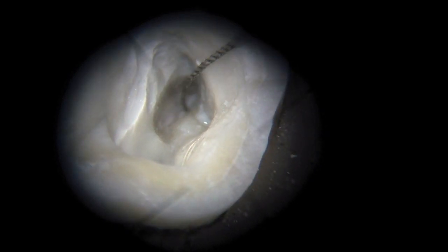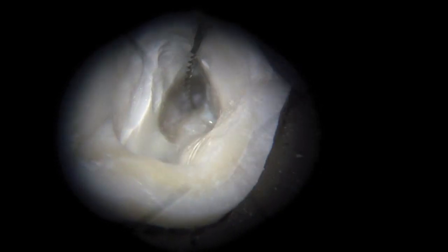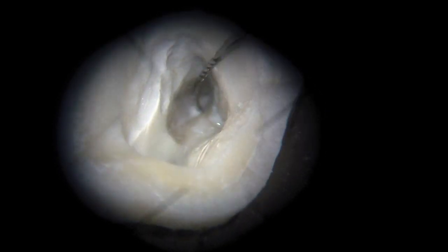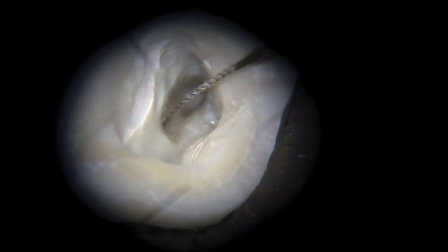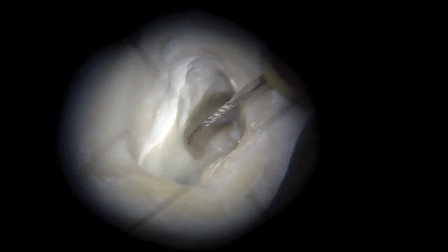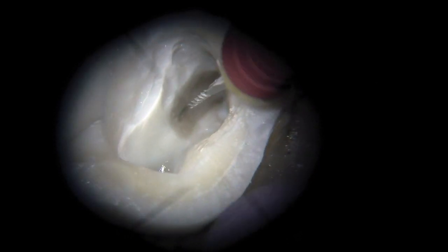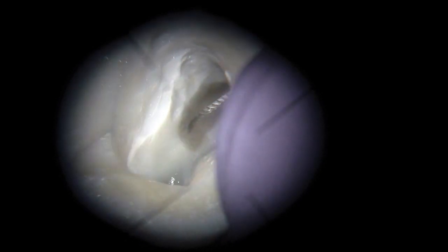What I'm trying to show here is that MB1 goes right around the corner — the file drops in and right around the corner right there. So it's important to know that when trying to develop straight line access, you want to eliminate as many curves as possible, especially at the coronal portion of the orifice of the canal.